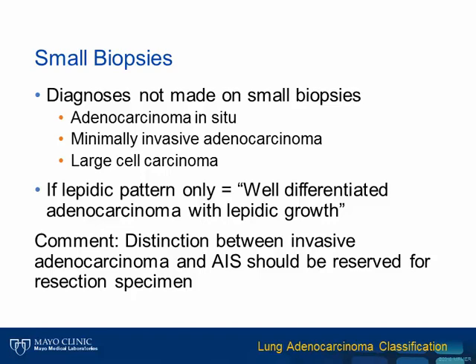If a biopsy only shows lepidic pattern, this might be signed out as a well-differentiated adenocarcinoma with lepidic growth, and then see comment, and a comment might state that the distinction between invasive adenocarcinoma and adenocarcinoma in situ should be reserved for the resection specimen.